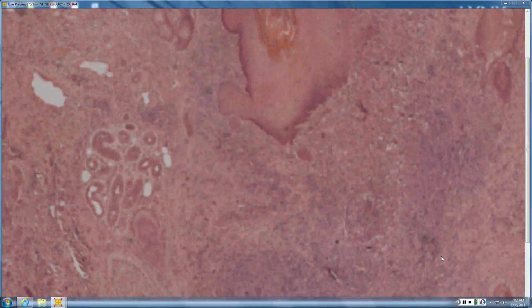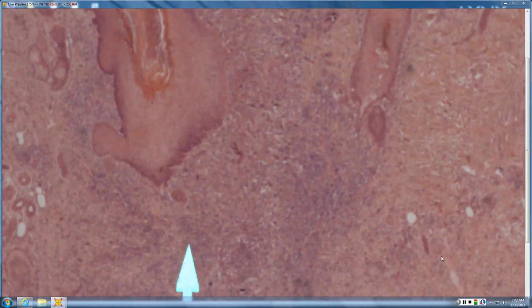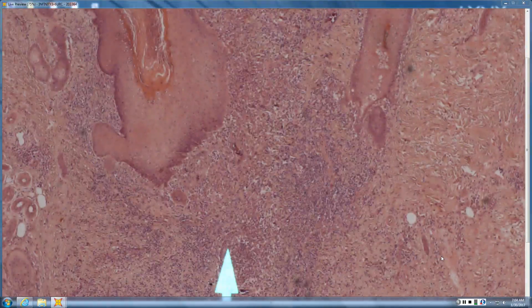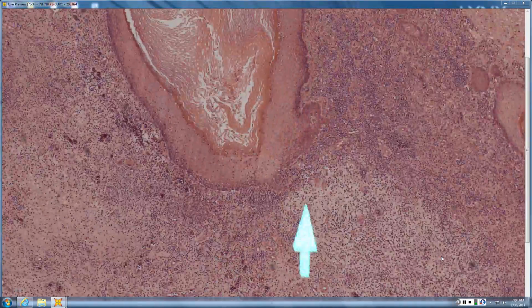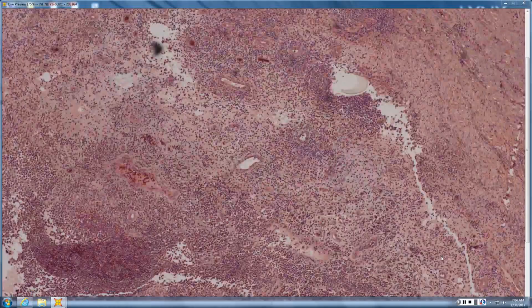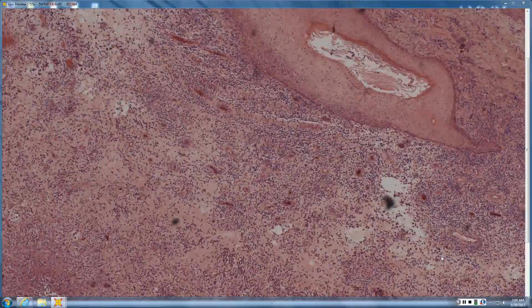But what you're really just going to find is bacteria and all these microabscesses, and it'll be chock full of neutrophils. But you won't find any other infectious entity. And a lot of times it will be more round follicles that are dilated because it's a suppurative folliculitis. All this is just tons of neutrophils and debris and whatnot. That one is Hidradenitis suppurativa.